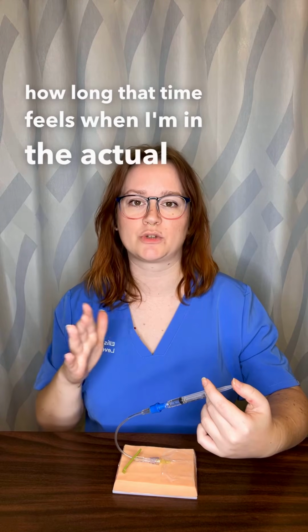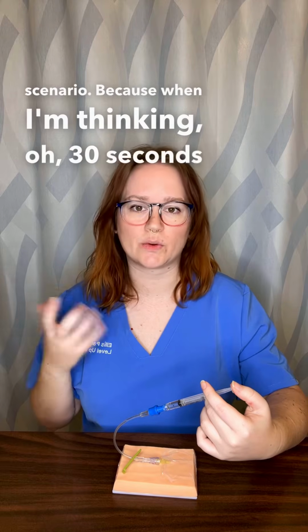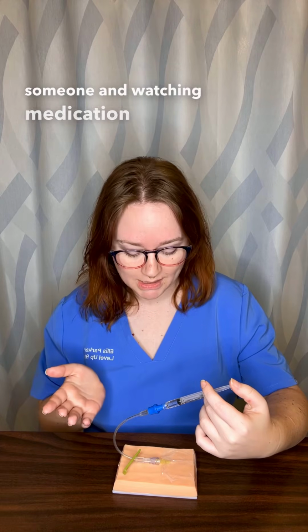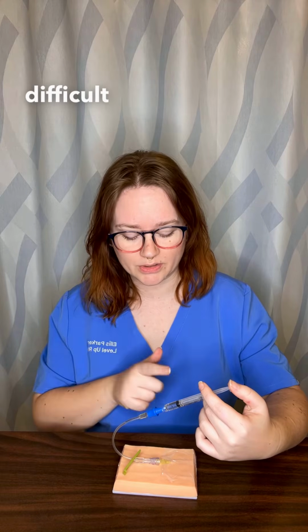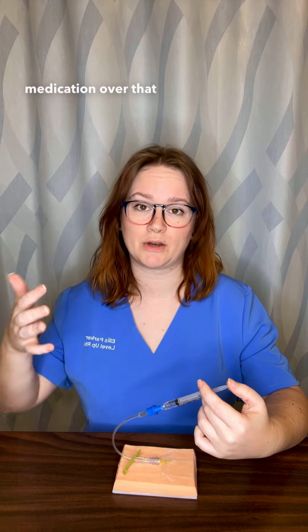What I think sometimes can be hard to imagine is how long that time feels when I'm in the actual scenario. Because when I'm thinking, 30 seconds, or it's only 2 minutes, that doesn't feel like a long time right now. But when I'm standing with someone and watching medication go into the tube, it feels like such a long time. It also can feel really difficult to make sure that I'm consistently administering medication over that period of time.